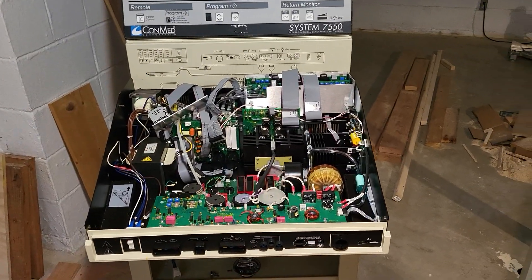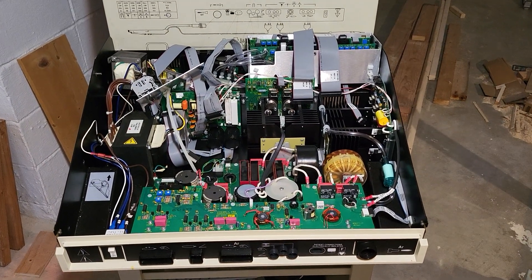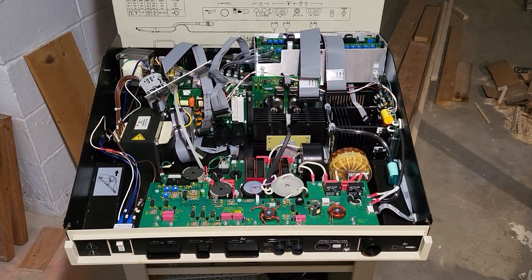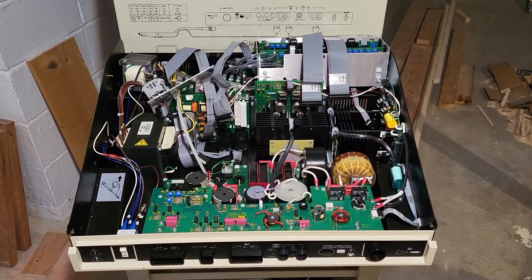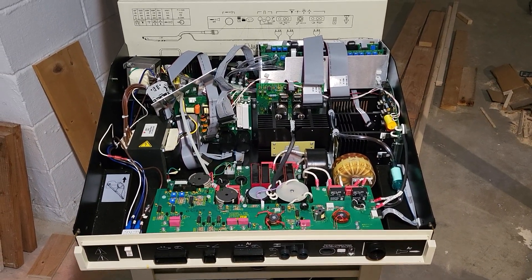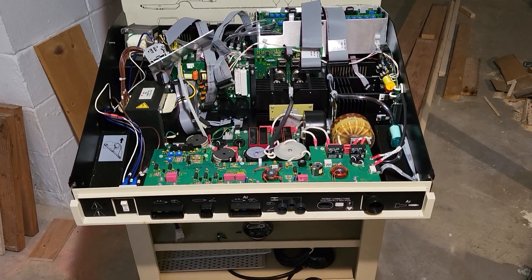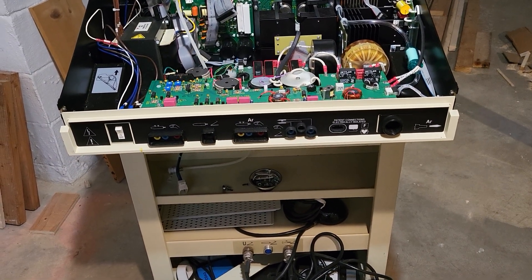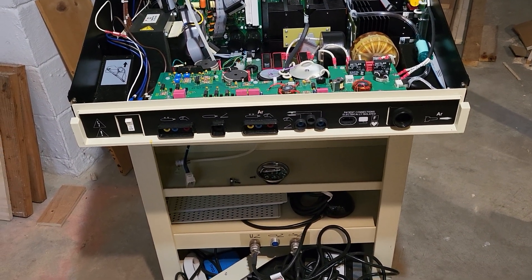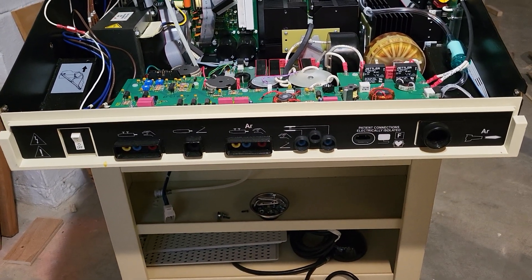And that's what we want to be able to see right there. We're going to reconfigure how they're sitting in the chassis, paint the chassis and brighten it up, probably throw some lighting in there, and identify test points. This front end here, we're going to tilt it up slightly so that when you're standing in front of it, you can better see the icons and things of that nature.